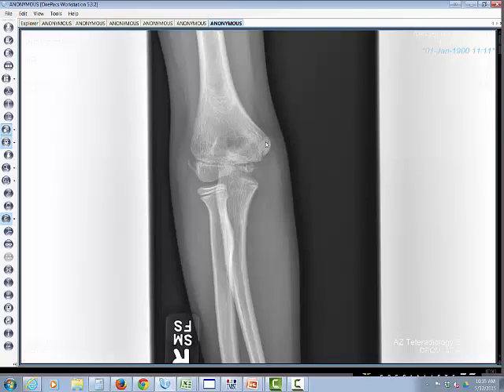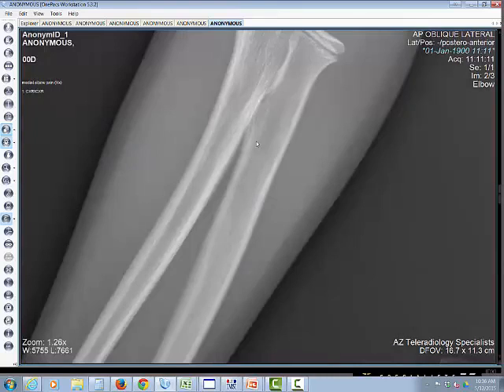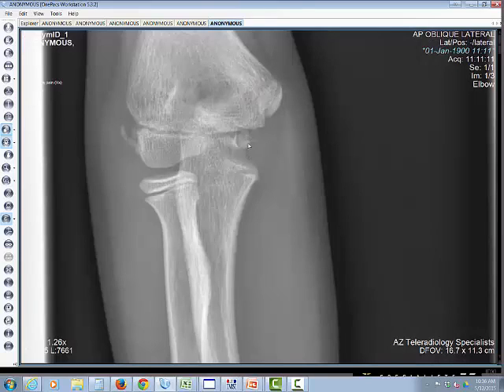The other ossification center that's seen very early on is the capitellum. And this is very typically just a large, single, well-defined ossification center, as opposed to the trochlea, which is next to it, shows up later, and is almost always a multipartite, multifocal type ossification center with some irregularities. You can look around it and see little areas of calcification all within it. This is a typical normal appearance for the trochlea, unlike the capitellum.